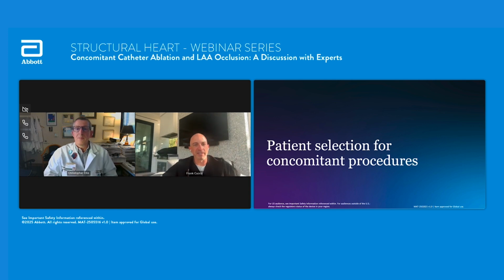Sure, Chris, thanks for having me. I really appreciate it. I echo Chris's sentiments. I think in today's modern ablation era with the use of PFA, this is where concomitant procedures become much more practical and realistic. Prior to this, some radiofrequency or other cases were taking a significant amount of time, and additionally, there wasn't CMS reimbursement for concomitant. I think those were few and far between.